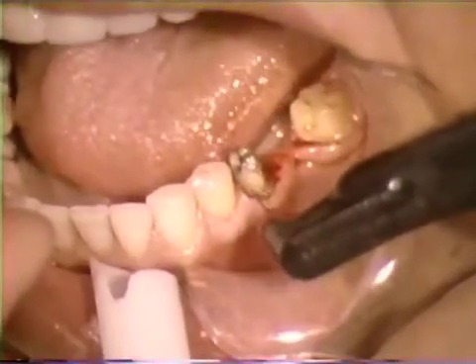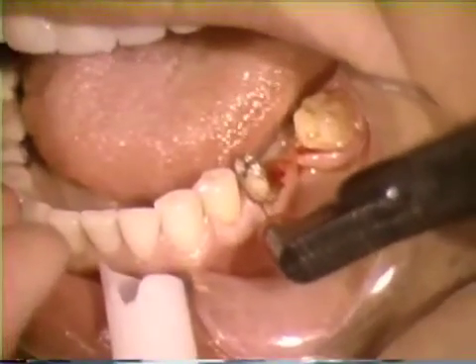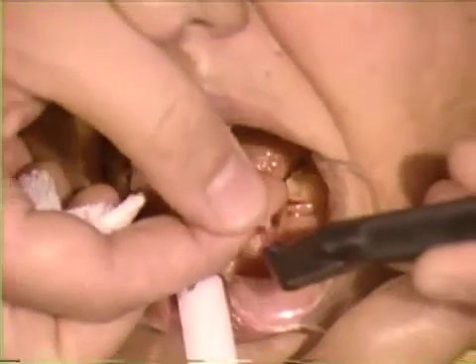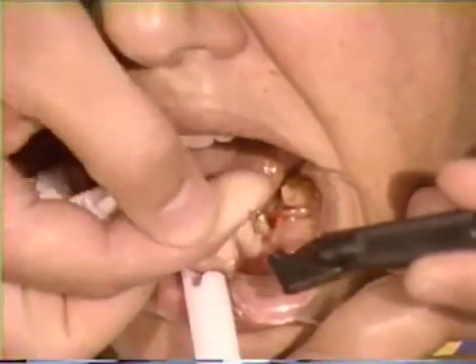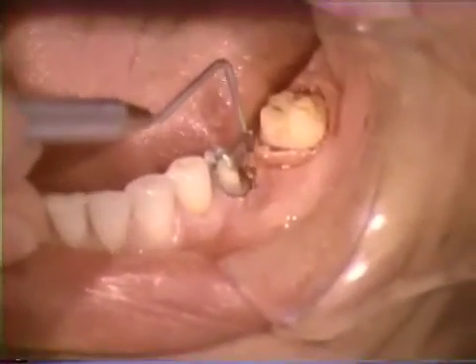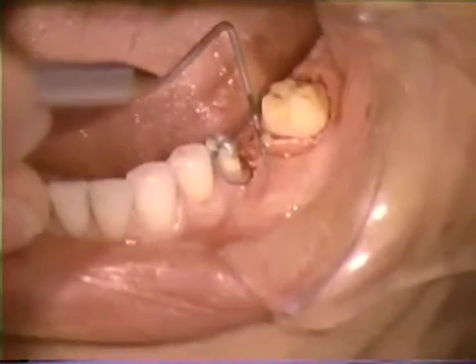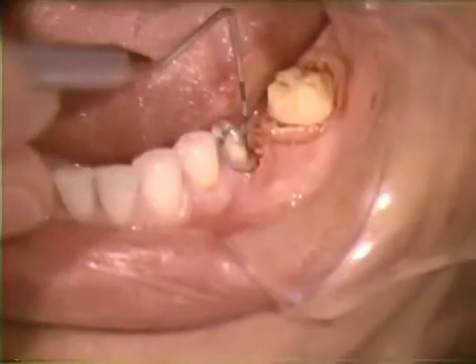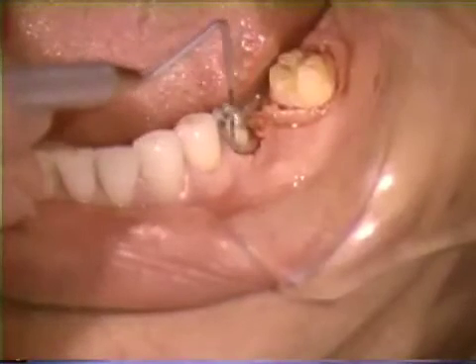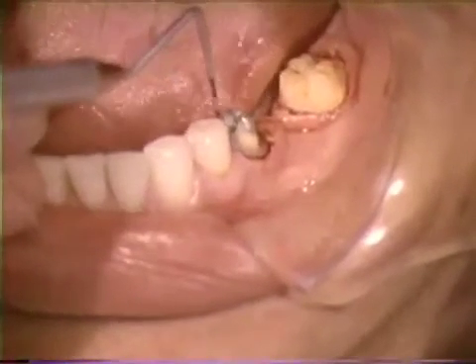Notice that the electrode tip is never hot — it may be touched immediately after release of the activating foot control or switch. As a final check, an incrementally marked probe is used to evaluate remaining attached tissue and sulcular depth. Both prove to be within normal and acceptable limits.